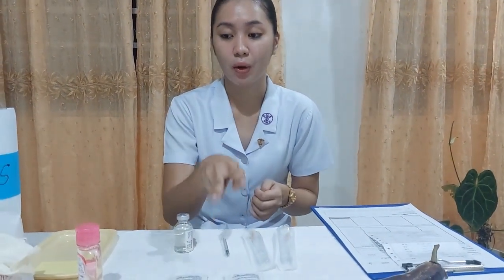As you can see, I already have it all here. I have the needles, the filter needle, the syringe, the antiseptic wipes, the alcohol, the clean working gloves, the medicine tray, and also the pen that we'll be using. Now that I have organized my equipment, I am good to go in the preparation of medication for drug withdrawal.